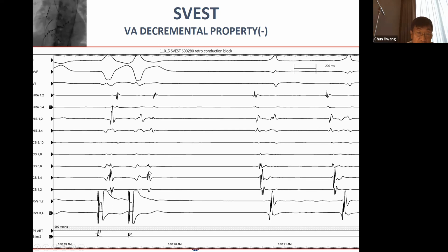Your EGM changed, right? Atrial activation, CS1 to 2, is far away from the pathway. And then look at the before. In that capture fusion beat, the A is completely different, right? So what changed here is that the early atrial activation EGM we pointed at earlier is gone, as the pathway blocked. But what I'm asking is this.